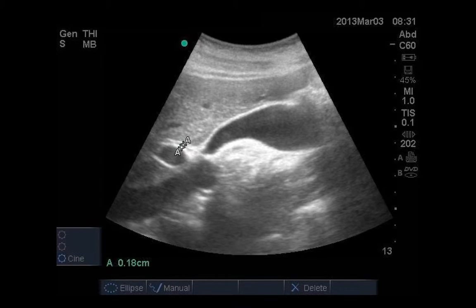This diameter can increase normally with age, and some have recommended that the diameter should be less than 1/10 of the patient's age. Another common method to determine normal is to add 1 millimeter per decade over 60 years old. For example, 7 millimeters may be a normal measurement in a 70-year-old patient.